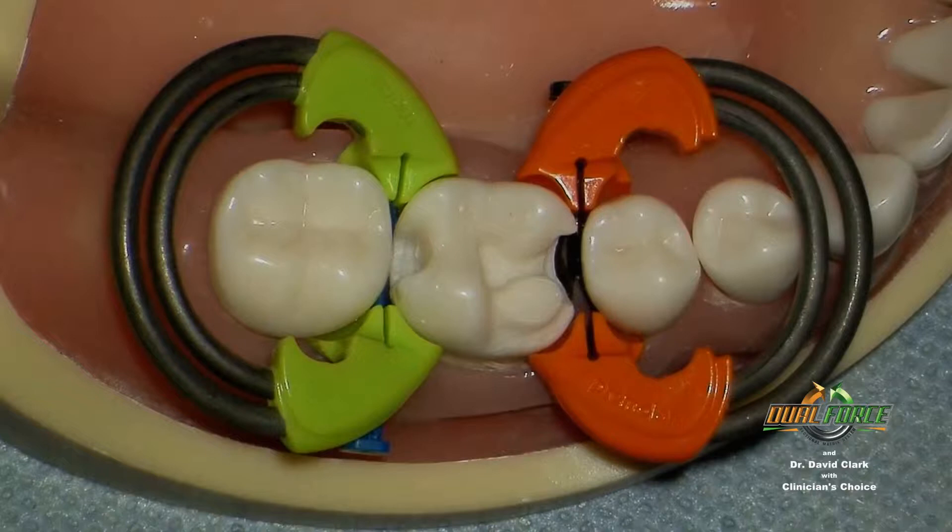Let's review the problems that we see with the current matrix systems. First, the matrices — they don't slide in place very well, and they lack proper shape. Next are the wedges. The current wedges fill the space, but they do not adapt well, which results in overhangs at the line angles or at the mid-tooth concavity. This leads to poor health around the restoration or time wasted trying to remove the overhangs.